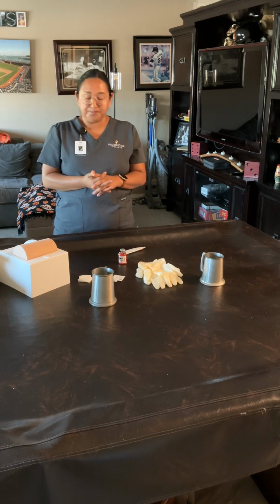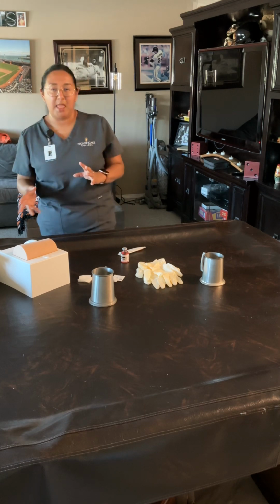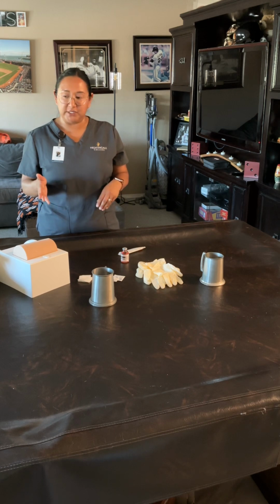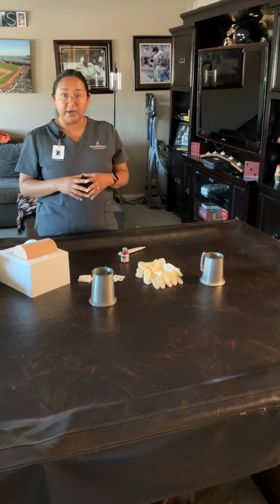And I'll confirm that I have the correct vial, which I already did, and I calculated the dosage for the heparin for the patient, and it needs about 1 milliliter, so that's about 1,000 units that I'll be administering of heparin to the patient.